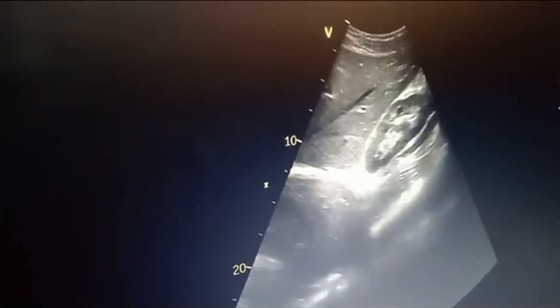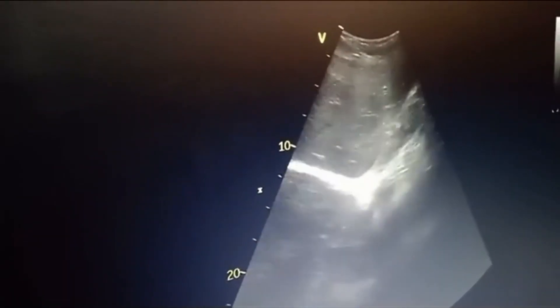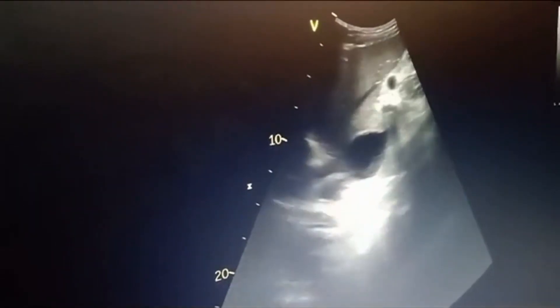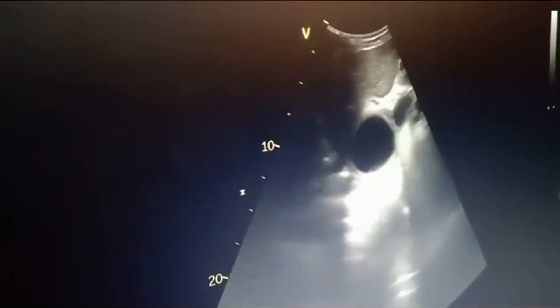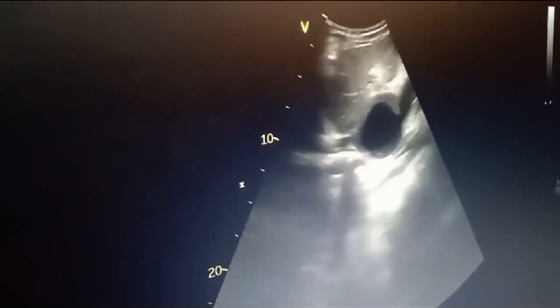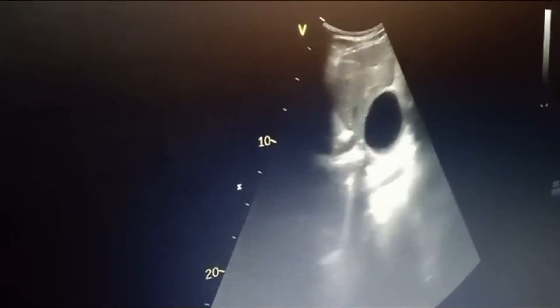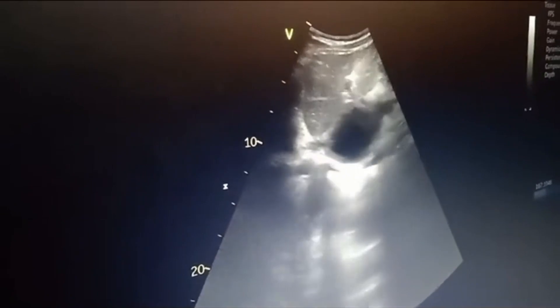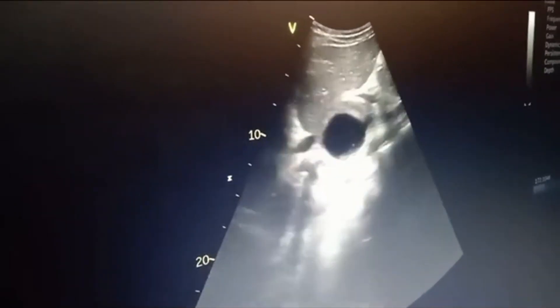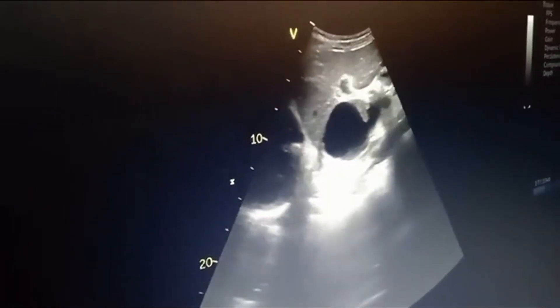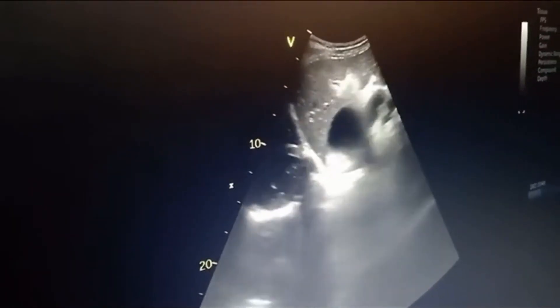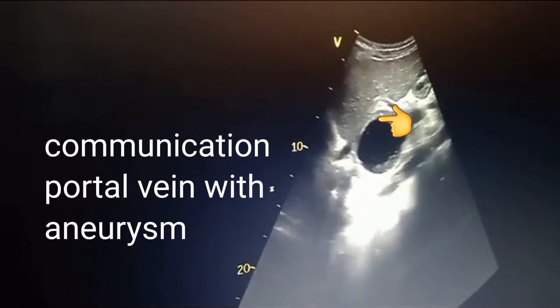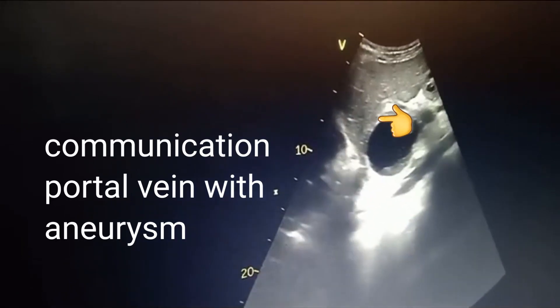Thrombosis within the portal vein aneurysm poses significant health risks, such as the potential for clot formation, embolism, or even complete blockage of the portal vein. This highlights the importance of early detection and intervention.